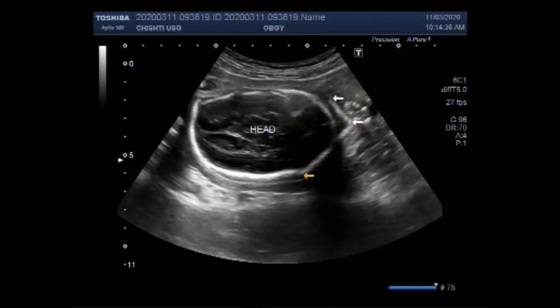You can see the fetal head and overlapping of the fetal skull bone is visible. This overlapping of the fetal skull bone is called positive Spalding sign.